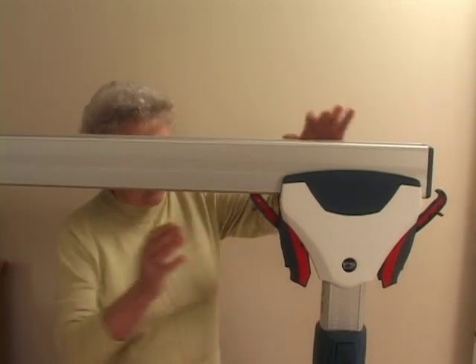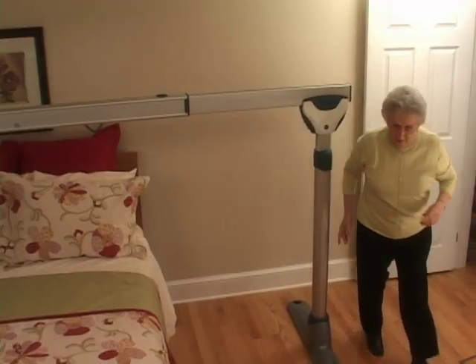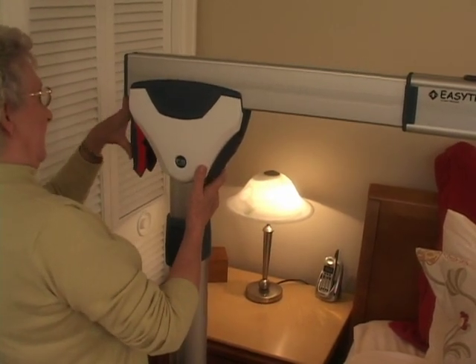The telescoping posts include height indicators that allow you to adjust both posts for a perfectly level top rail. On top of the posts, you'll find two locking clamps. These clamps securely fasten the top rail in place. To insert the top rail, the locking clamps on both posts are opened — pushing down on the security catch unlocks and opens the clamp. Now you can install the rail. The two clamps close on locking pins within the rail. You know the top rail is secure and locked in place when the red indicators on the locking clamps are no longer visible.